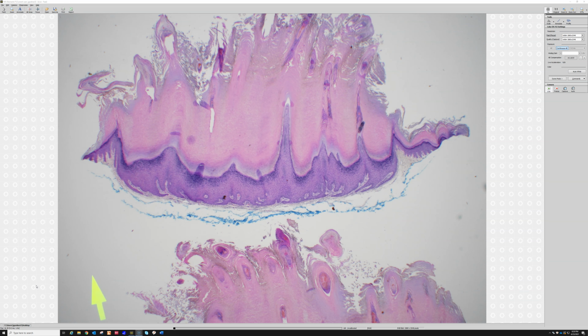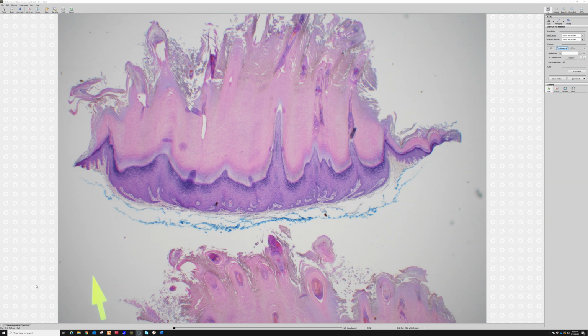Another interesting thing is, look, this wart is kind of cup-shaped. It's what we call endophytic. But it's also a little exophytic too. It's got papillae still, but the bottom of the wart is actually sitting down below the skin surface. So that happens sometimes with warts, particularly warts on acral skin, palm or sole skin, fingers or toes. You can get this very endophytic push-down wart where it's got the features of a verruca. It's got the papillary projections, the papillomatosis here, but they're sitting down in a bowl or a cup that's pushed down into the dermis.